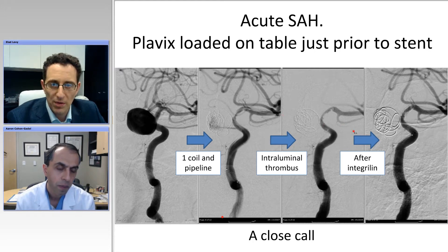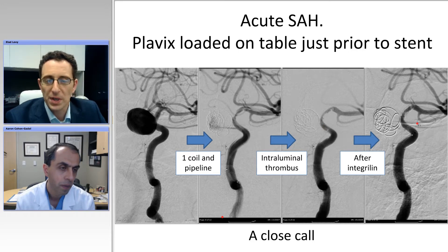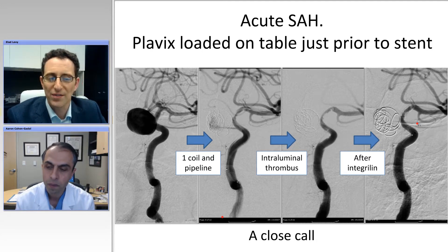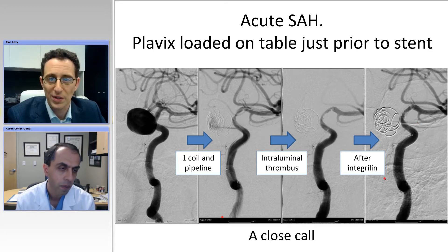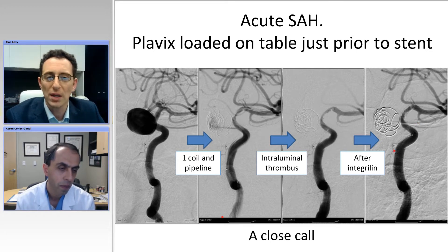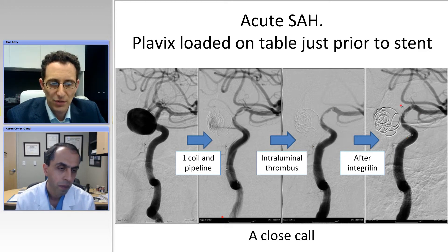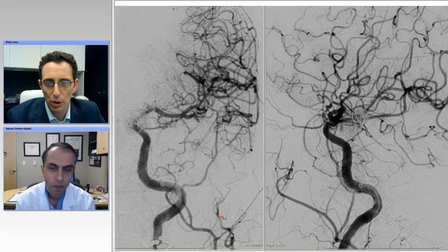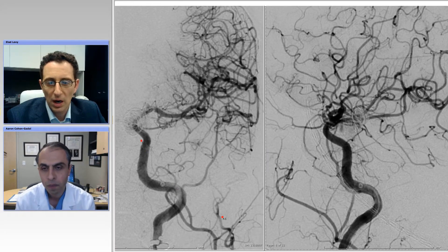At this point, we have a couple of options. We can let the vessel occlude and hope that there's enough collateral. But because this patient was intubated, we could not do a balloon test occlusion — we can't risk taking the vessel down, which is why we tried to spare the vessel with a stent and a flow diverter. So we gave a 2b/3a inhibitor, Integrelin, just the bolus. After the bolus, blood flow appears to be improved. Now we have complete occlusion of the aneurysm with one coil and one flow diverter, and that jet that was seen is no longer present. Here in the follow-up angiogram at the end of the case, you can see flow of the vessel.